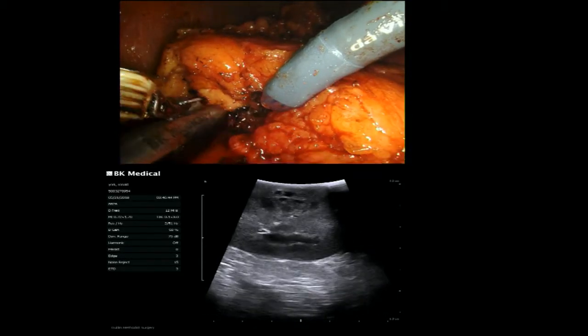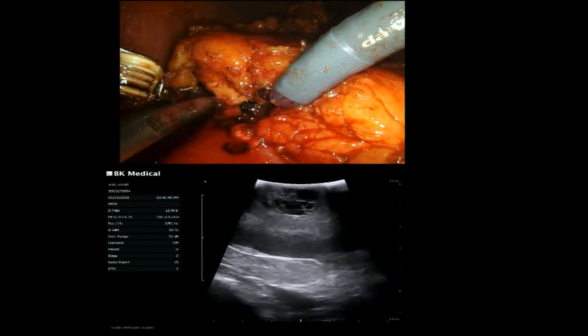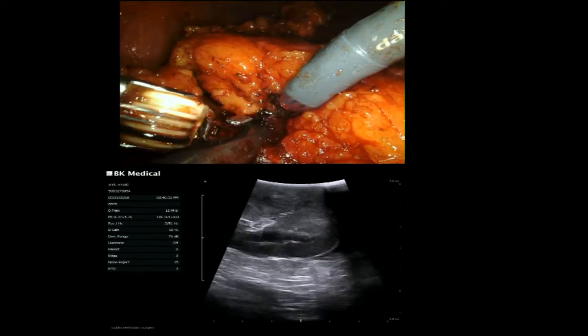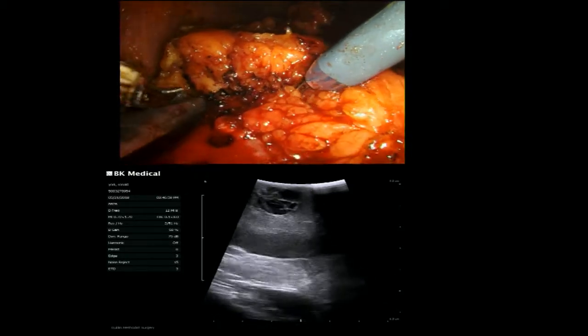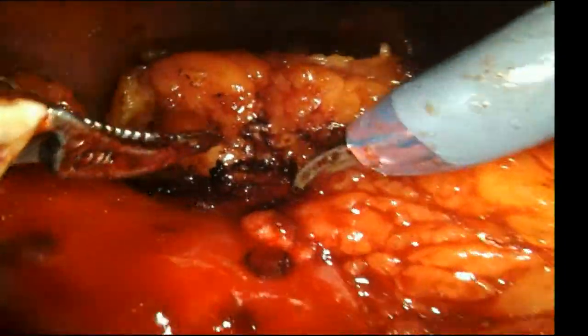And Ronnie, do you recommend that all people that do partial nephrectomies use the ultrasound all the time, in helping with the learning curve? Yeah, absolutely. To me, it's not a luxury item. It's a necessity. You've got to use it. I agree, because you get much more facile using it and interpreting it with time and experience.